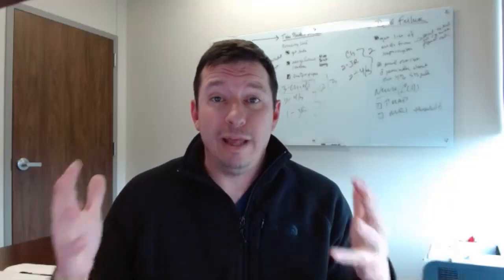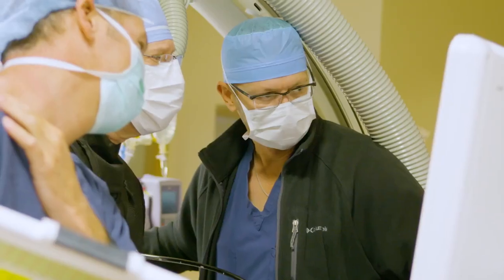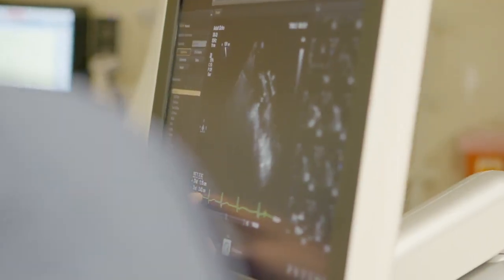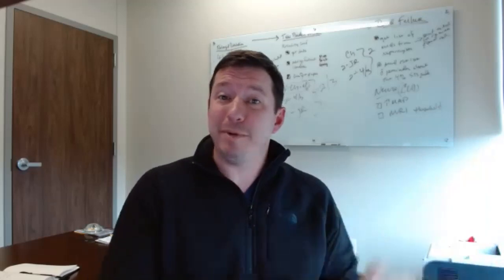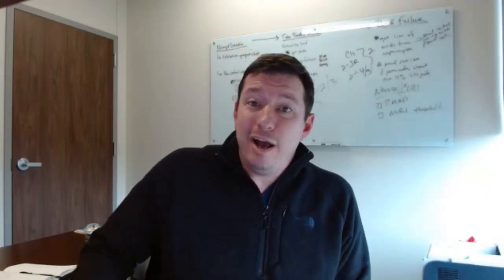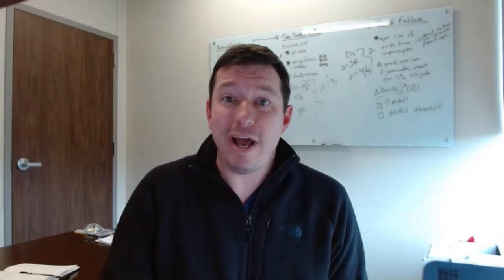First off, it's a heart team approach, which oftentimes means that there's a cardiac surgeon, a cardiologist, and an imaging specialist all involved, which means you're getting three minds involved in placing this one valve. And the big thing that the patient notices, because that's all happening in the back end or in the midst of the procedure, is they see a poke hole in the groin and they're going home the next day. They usually get an echo before they leave that confirms, hey, the valve is looking good, but the overall experience is a much shorter one than the original surgery was.